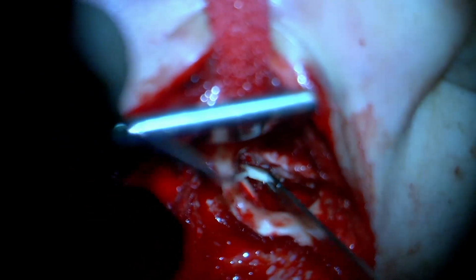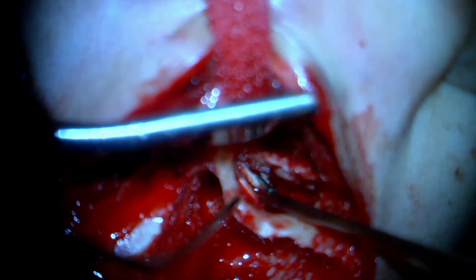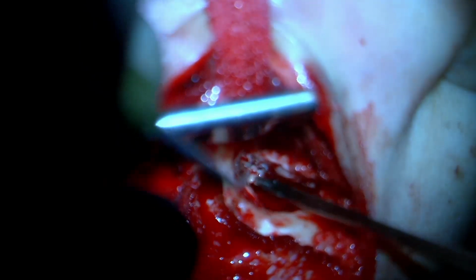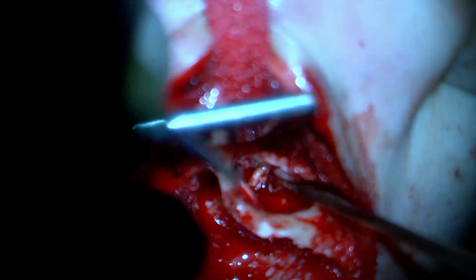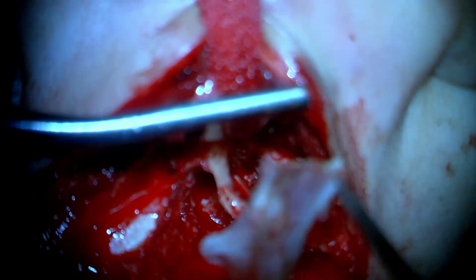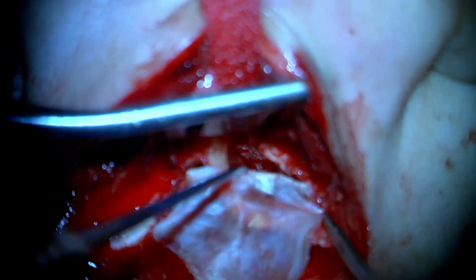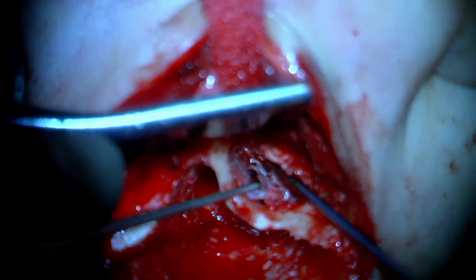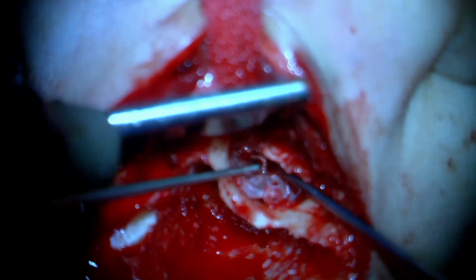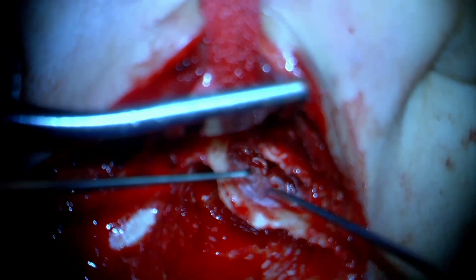There is a second piece of cartilage that goes for reconstruction of the exposed scutum that was eroded over the ossicular heads, the incus long process, incus short process, and portion of malleus head, over which eventually we will place our graft. So the graft would go underlay, that is medial to the annulus, but lateral to our cartilage grafts, both the one on the canal wall as well as the one that is there in the posterior epitympanum and superior mesotympanum.